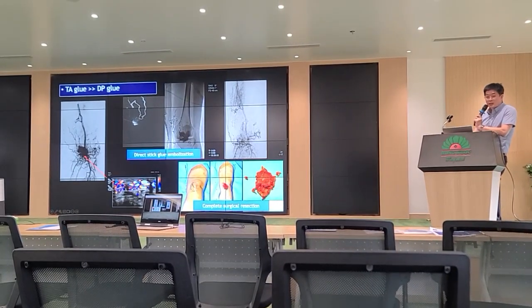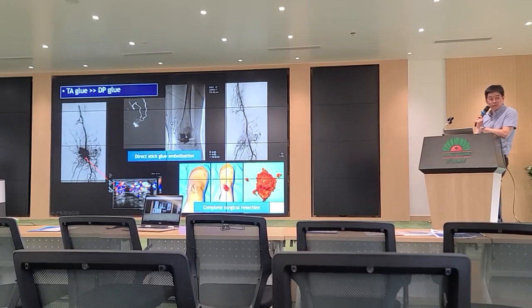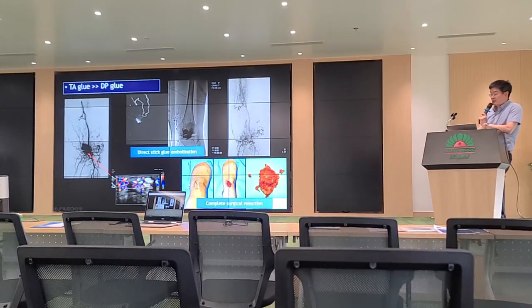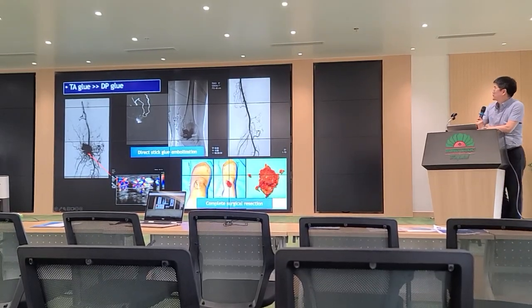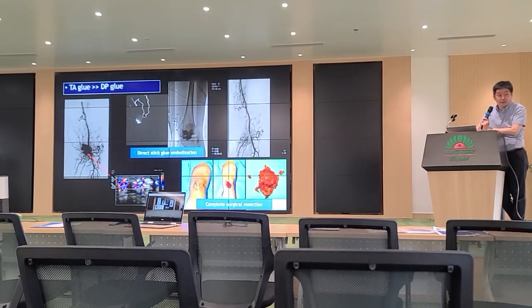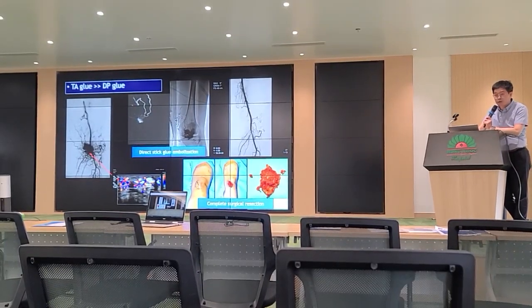redo the ultrasound and direct puncture of the lesion and injected the glue directly, and then the AVM disappeared and the lesion was resected by our surgeon. What glue did you use? Did you inject glue NBCA, with the ratio 1:1? 1 to 2. One glue and 2 Lipiodol.